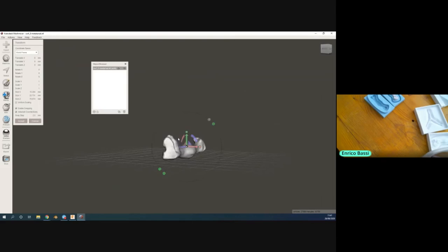I want to rotate it because you see that it's divided. I think it's easier to divide it vertically. So I rotate this. You notice that when you rotate it, if you hold it by here, you get a very smooth rotation, while if you grab the disk, you snap and get 5 degrees at a time. So to rotate it 90 degrees is enough to get to the outside ring. I could also edit it from here if I prefer.